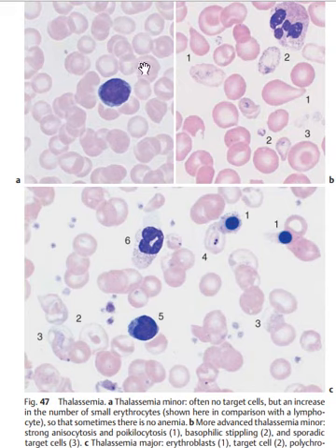You only have hypochromia. But when it is slightly advanced, you have both anisocytosis and poikilocytosis. Is it clear? So you also have a basophilic stippling. Basophilic stippling means that there is basophilia. Is it clear? Now in diagram 2, we have what is called some target cells can be seen.